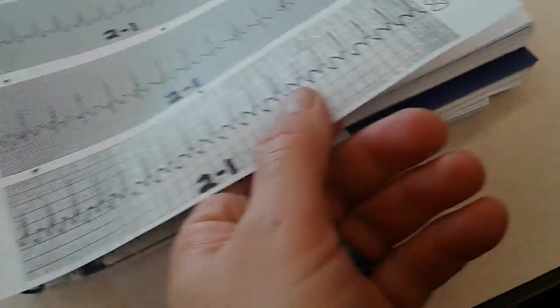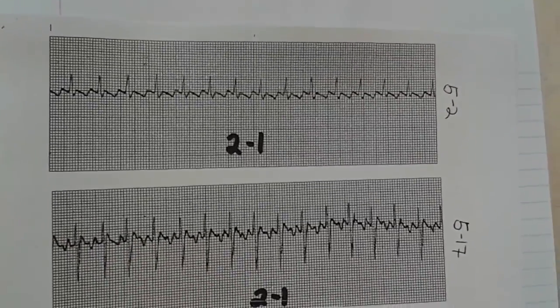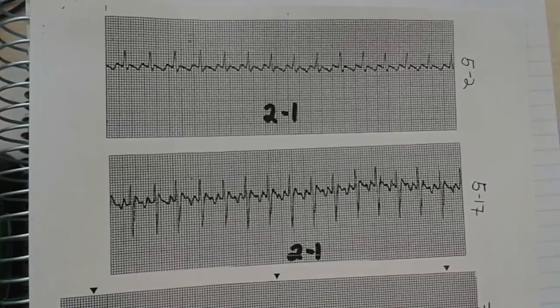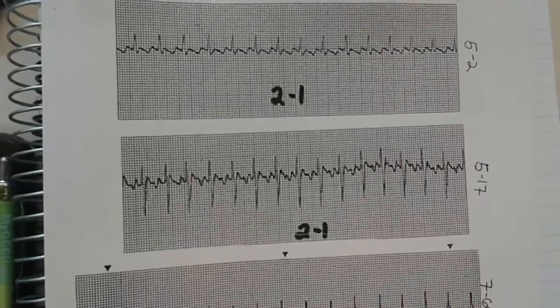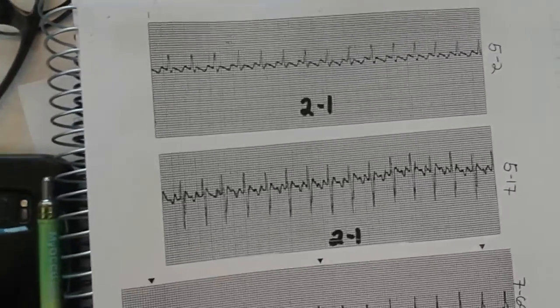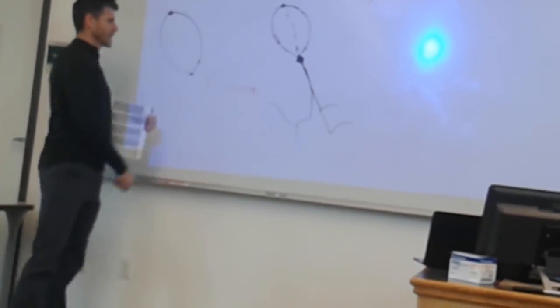Okay, starting from the front side on the 2 to 1s, you'll note that that's a 2 to 1 right there. You have the second F wave. Now remember that we call these F waves, not P waves, because they aren't really P waves anymore, because they aren't organized P activity. They're this reentry process, and we need to distinguish them a little bit. These are capitals. So we call these capital F waves.